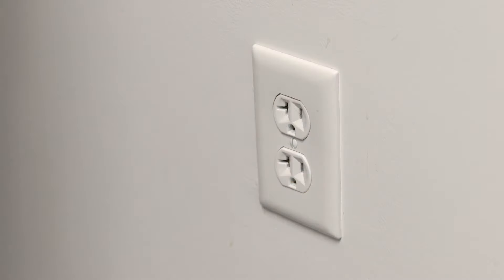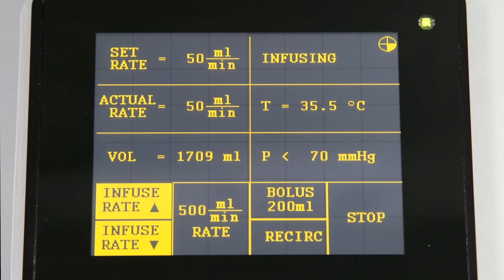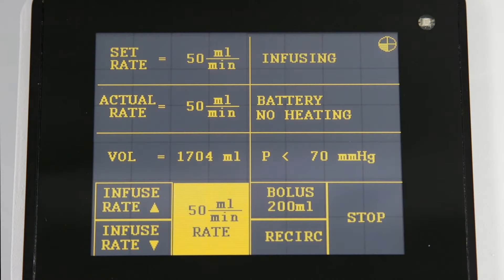Plug the device back into a dedicated circuit as soon as possible to re-initiate warming and adjust to a higher flow rate if needed. The battery is charged when the device is plugged in. A fully charged battery can provide infusion at the maximum allowed 50 milliliters per minute flow rate for up to 30 minutes.